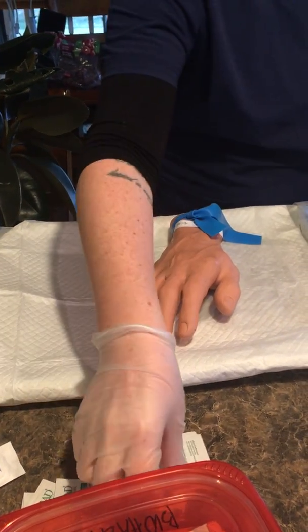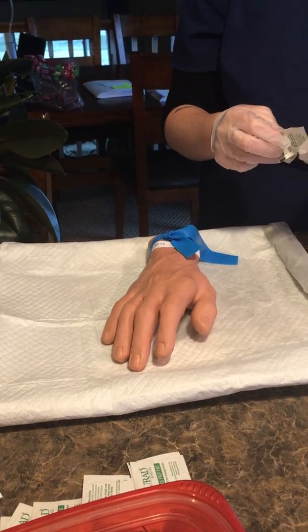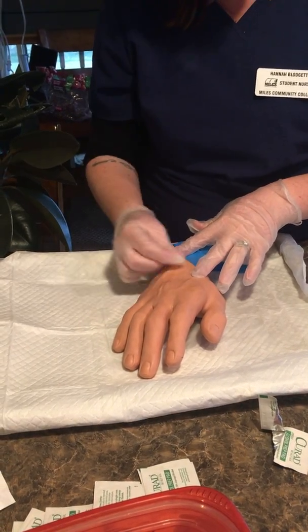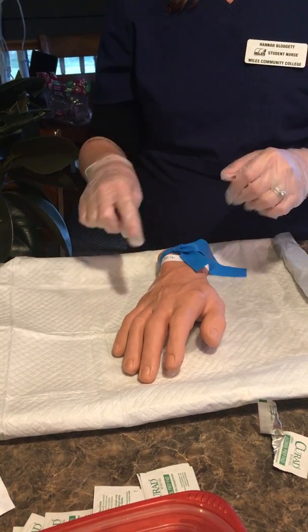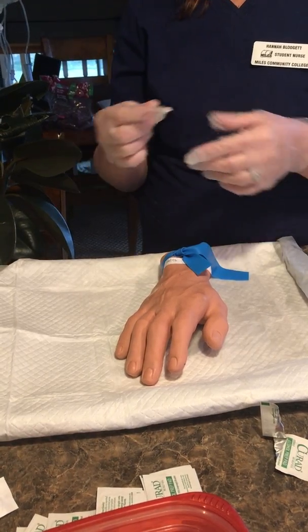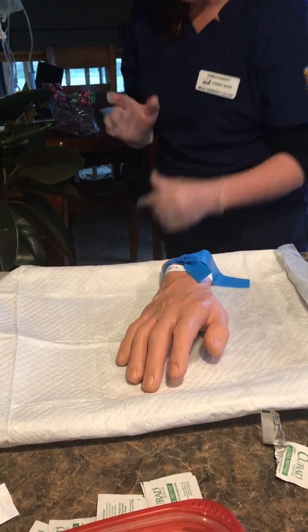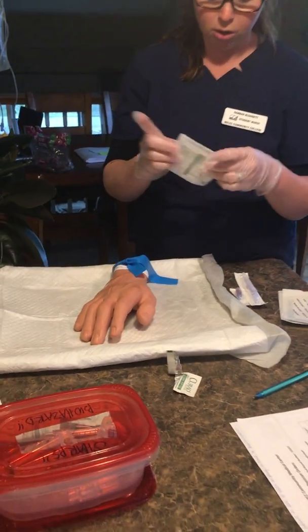I'm gonna use an alcohol pad. Make sure that site is really good and clean. And then I like to go back and feel again with my finger right before I put it in, in order to stabilize the vein. So I'm gonna alcohol my finger and keep that clean while I'm opening my supplies so that I can use that finger again later.